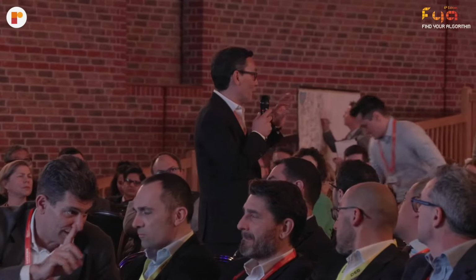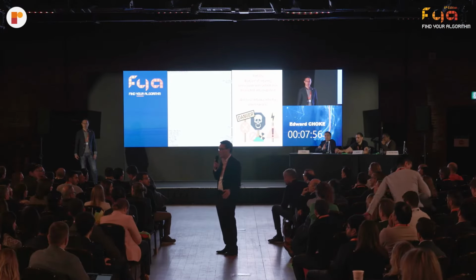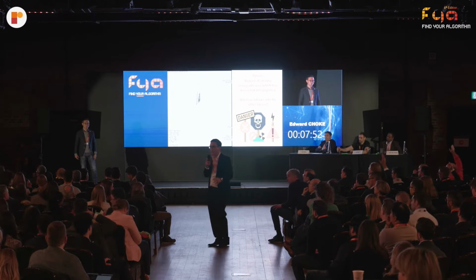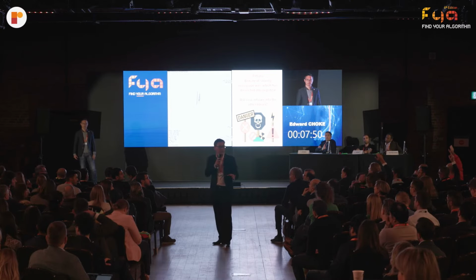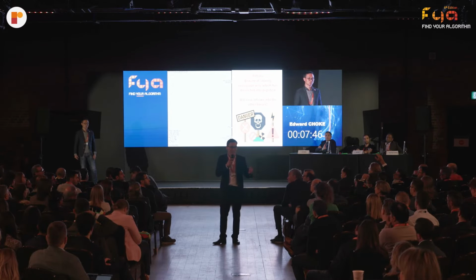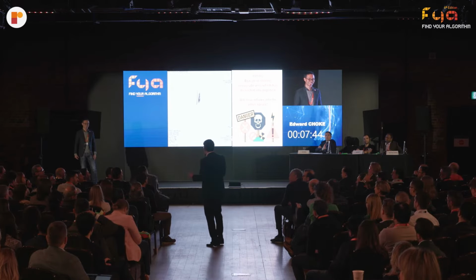Okay, sorry about that. Puncturing the P3 is not so frequent, and a lot of people are not aware of the technique itself. You have shown it more or less. How many of you perform a P3 approach from the anterolateral aspect, with the patient supine, and not from the medial aspect? Do you want to know how to perform that? Just yell, yes! Tell them.